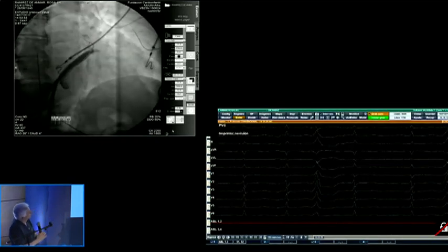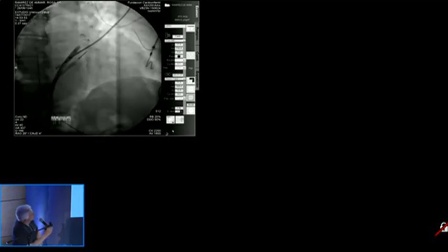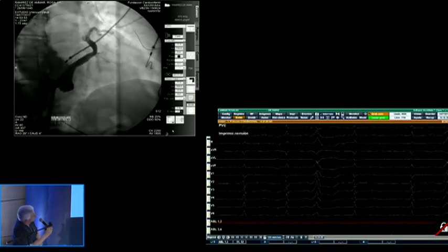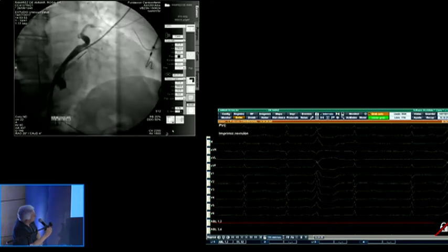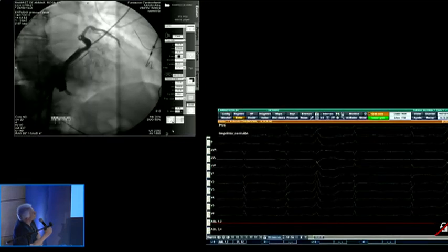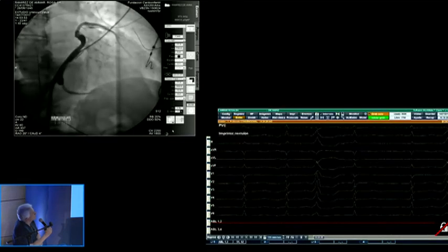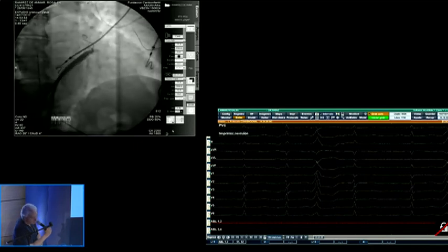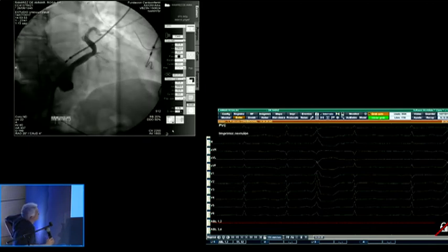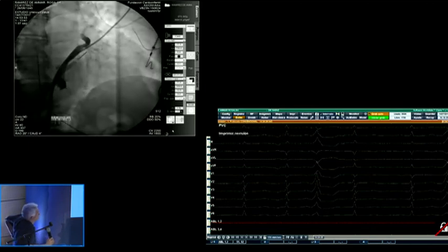So when you understand the anatomy, you can really try to advance catheters, and you're going to try to do it always as you do for any venous and arterial structure, using the guide wire, so that there is no possibility for the sheath or the catheter to perforate the free wall. Remember, the anterior vein and the major cardiac vein don't have coverage. These are more friable structures.